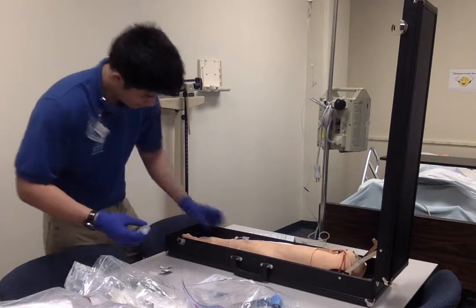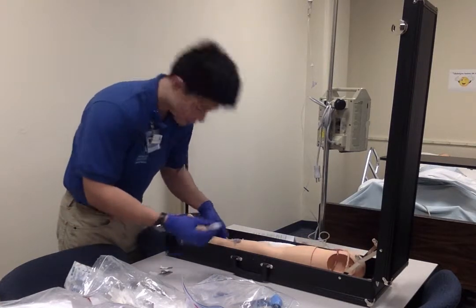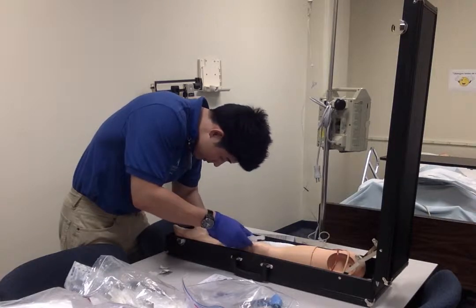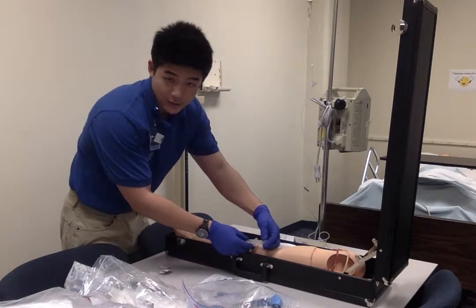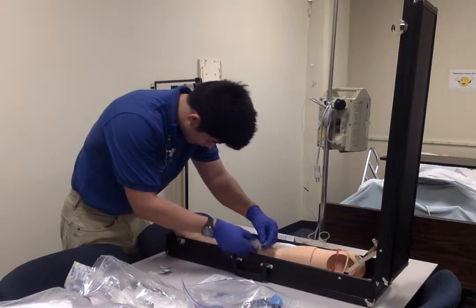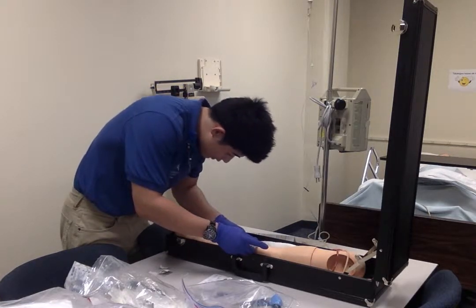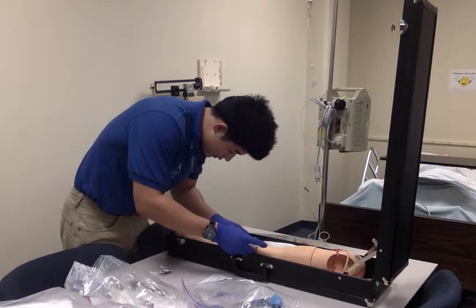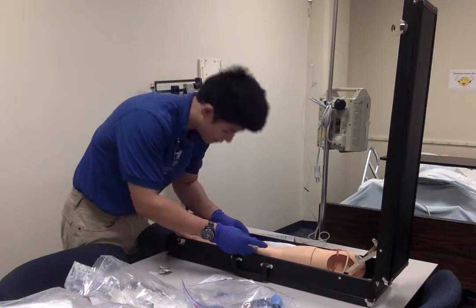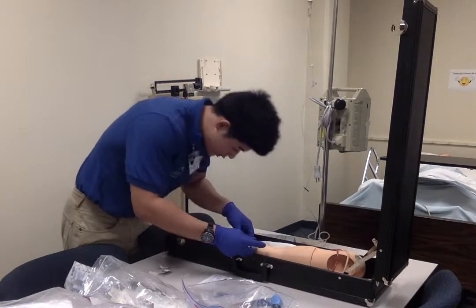So, here we go. What I'm going to do is aspirate. Yes, negative pressure. Now I'm going to go in slightly, 0.5 milliliters every time. And then applying positive pressure, I'm going to lock it.